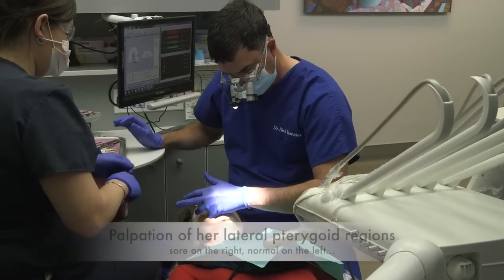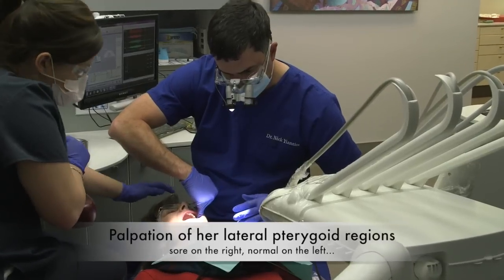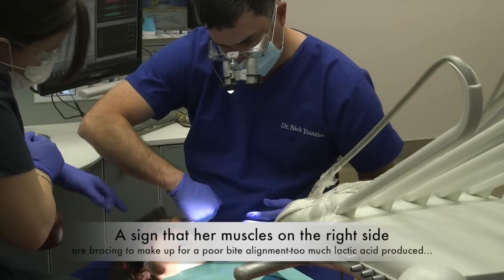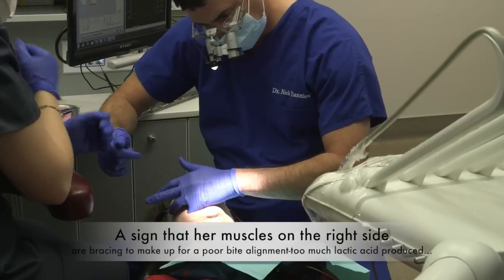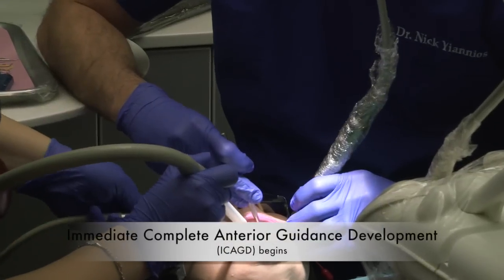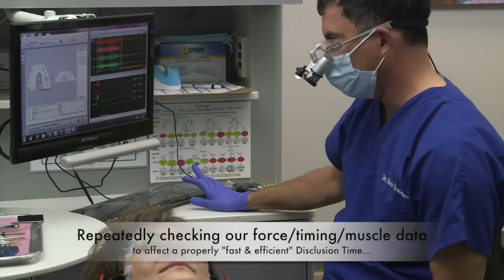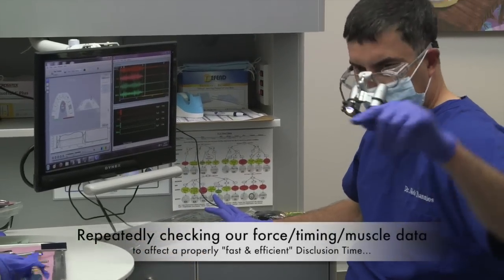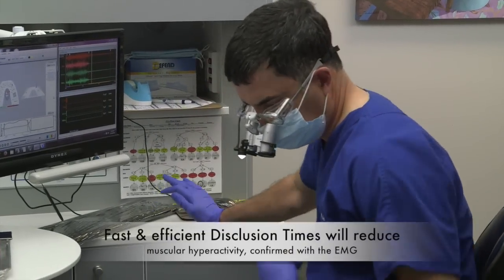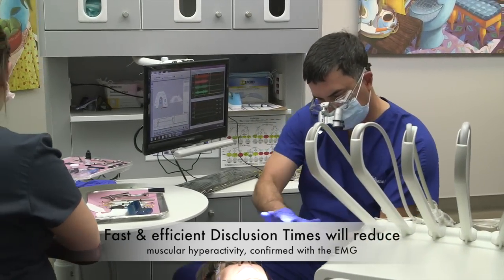When I palpate up here, does that feel tired at all? Kind of sore? It does, a little bit. How about when I go to this side? Just a finger or does it feel sore and bruised? It's not as sore as the other side. So your right side is profoundly different than your left. It's interesting — it was trying to go right and it went left again, kind of a loop-de-loop. Instead of just walking straight, it went around and then went this way. So the muscles have to fire longer and more — the muscles get tired. The brain doesn't like it and is always trying to shimmy it down.